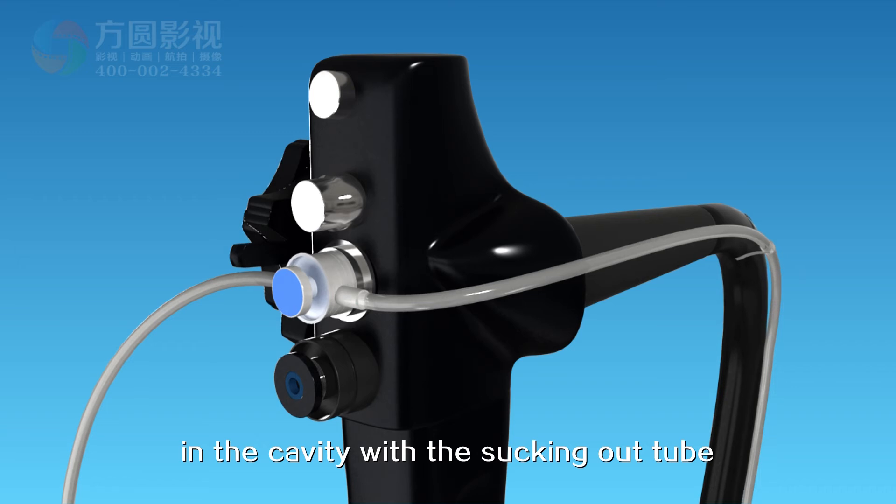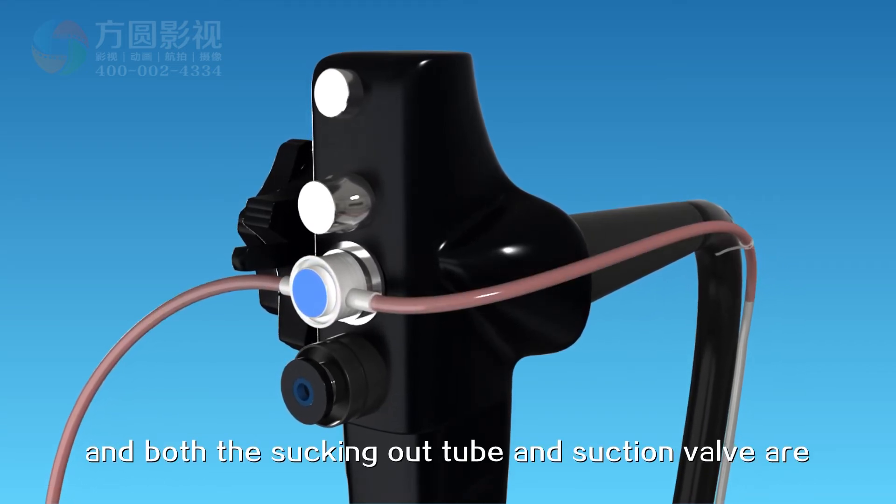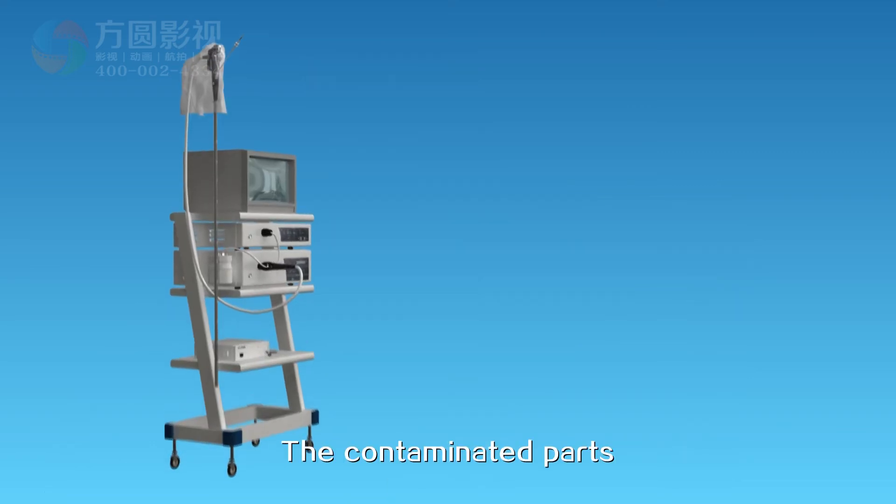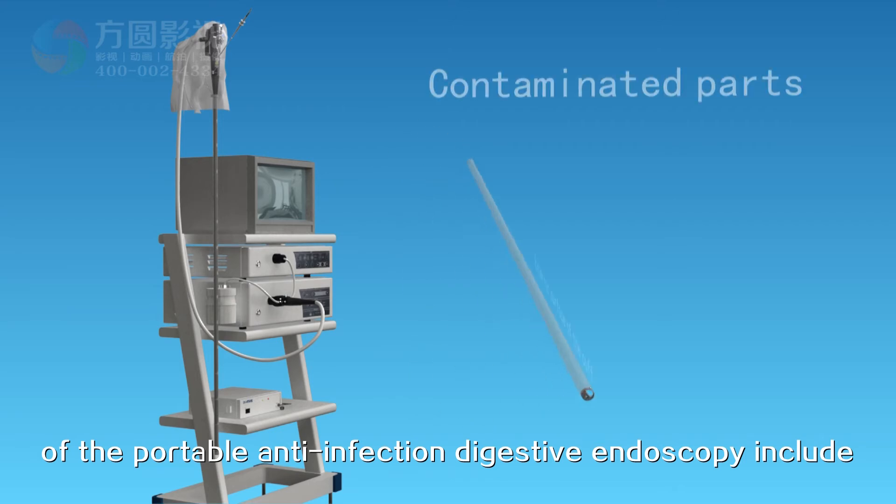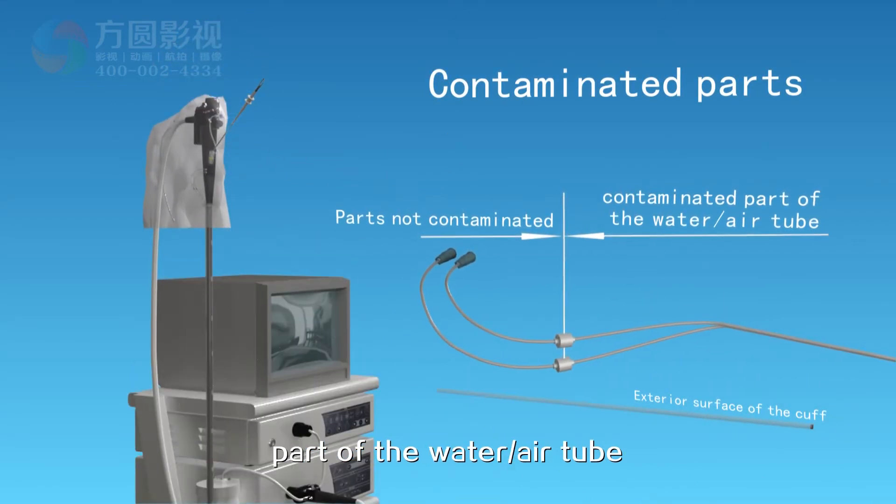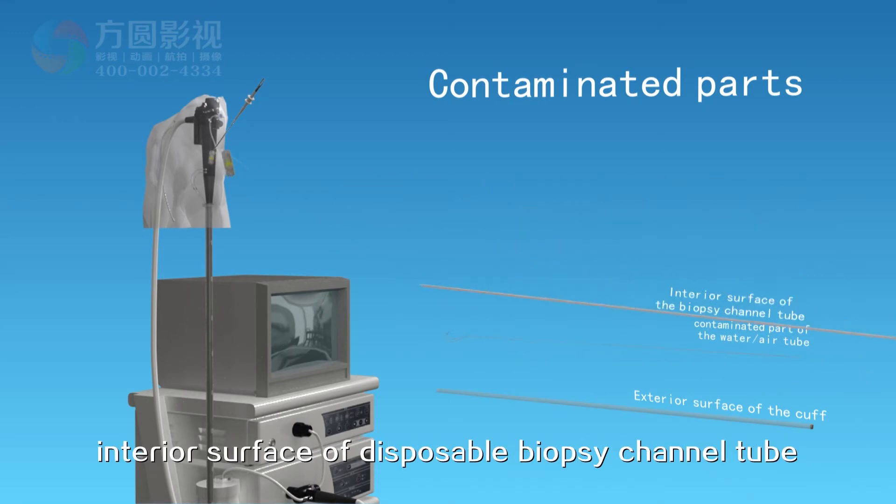Press the suction valve to suck out the fluid in the cavity with the sucking out tube. Both the sucking out tube and suction valve are on the outside of the lens body to benefit one-time use. The contaminated parts include the exterior surface of the disposable rubber cuff, part of the water air tube, and interior surface of the disposable biopsy channel tube.